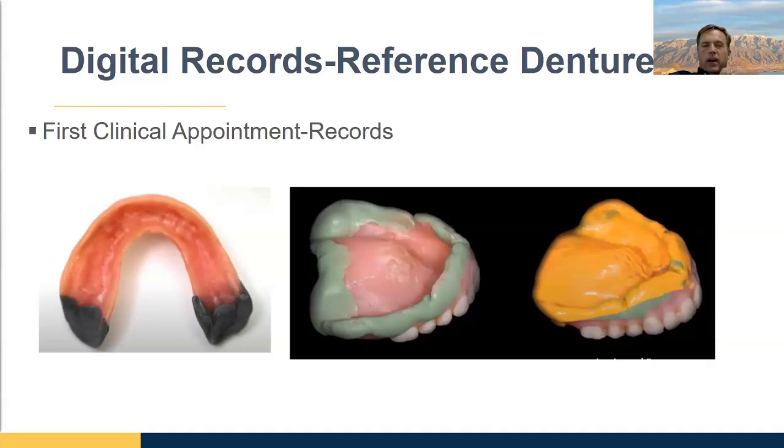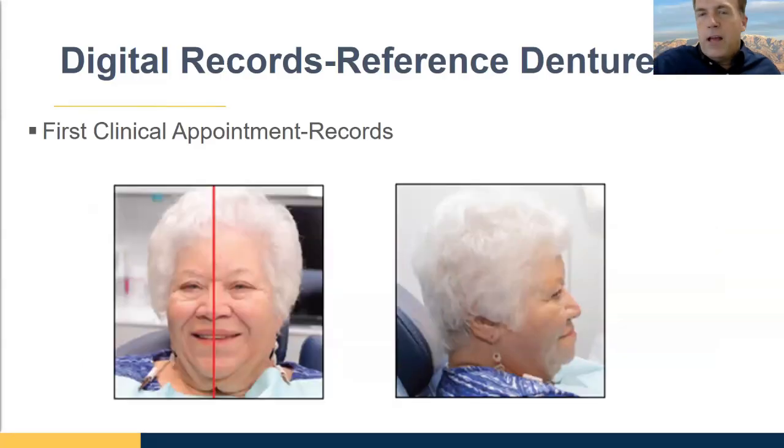Once you've gotten the reline done, you're ready to do your aesthetic evaluation. I recommend taking that reline impression first, so that the denture will be nice and stable for you. Then, like we see in the picture here, check the midline, check the bite, figure out where CR is in the video. Take your relaxed lips so we can get the incisal edge position. Take your high smile. Take your profile picture so we can see the opening and also the lip support. Make sure that looks good.